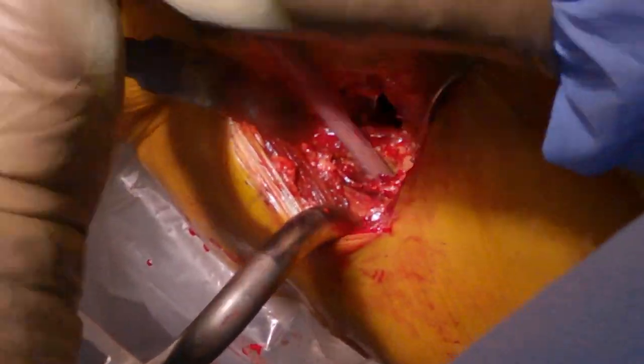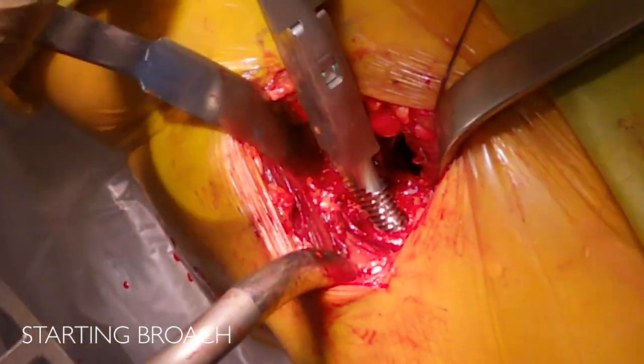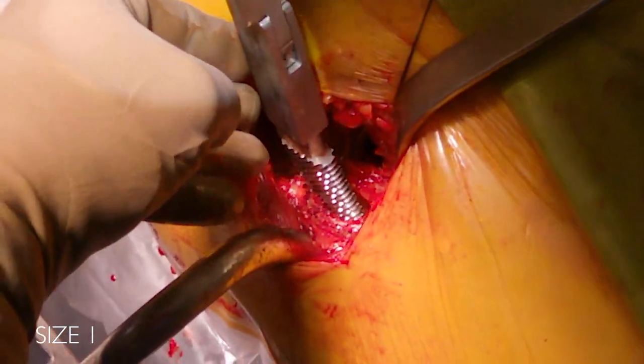Next is the starting broach, lining up with the middle of the calcar and easily finding the center after using the box osteotome and the canal finding awl. That was the starter broach — now moving to a size one, which is a little bit longer than the starter broach.